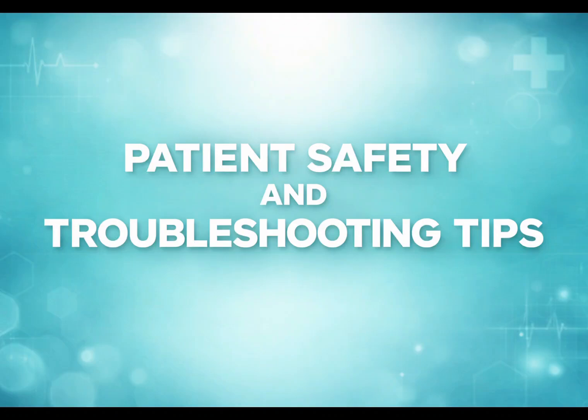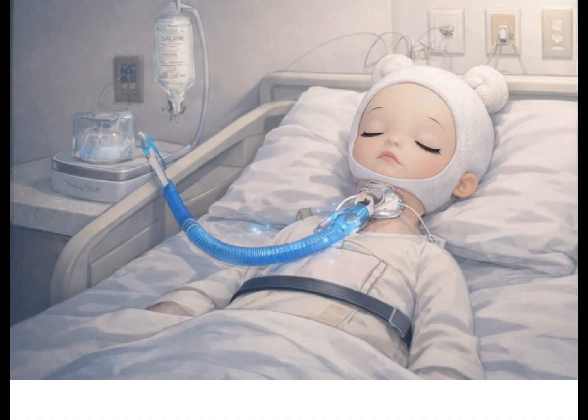Now that we've established the importance of having both airflow signals, let's walk through a few clinical scenarios. Even when a setup appears perfect in the room, the signals may not always reflect the patient's true condition. Recognizing these patterns is essential for both patient safety and accurate scoring. Misleading signals can result in incorrect scoring, or worse, missed signs of patient distress.